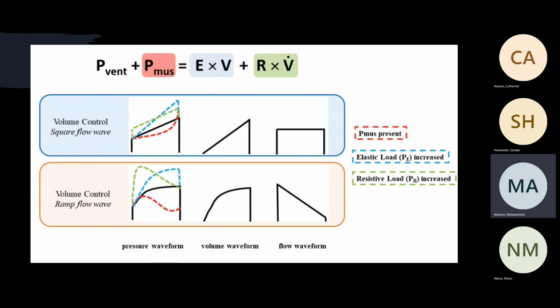However, the pressure is a continuous pressure. It's not just one pressure goes in and that's it, done. It's a continuous pressure that will show you. But can I make sure and differentiate by looking at the wave? Me personally, no, and I don't think it's doable. But I don't know, do you know? Just me.